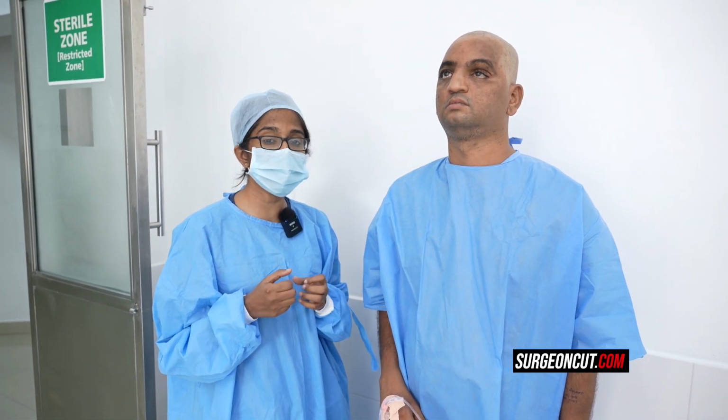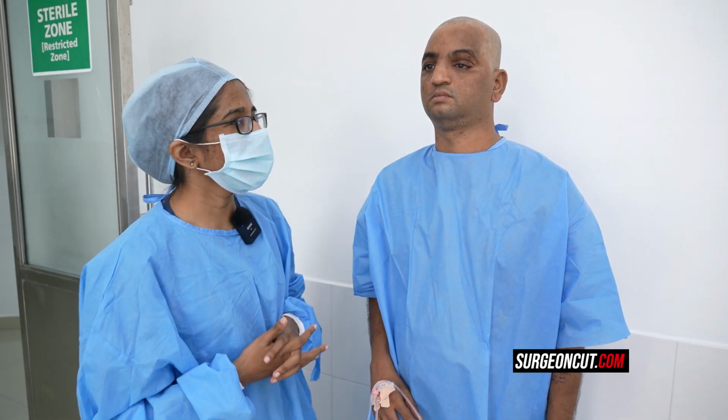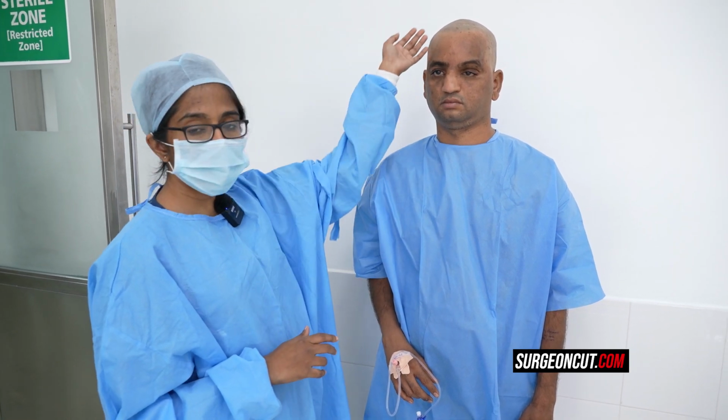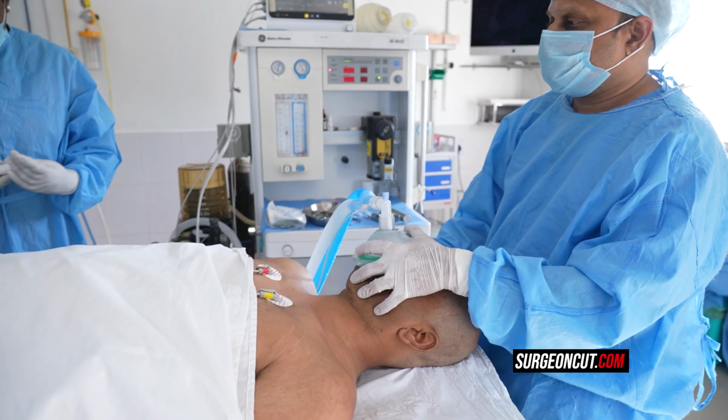I mean, he's able to see, but it's a bit blurred. We will not be addressing that issue, but if there is entrapment of any muscles, that can be corrected. But we do not expect any functional visual outcome from this surgery because this is a very old case, back in 2017, and we are now in 2021. So today we are going to do orbital reconstruction through a bicoronal approach. The scar will be well hidden beneath his hair, and this surgery will take anywhere between 2 to 3 hours.